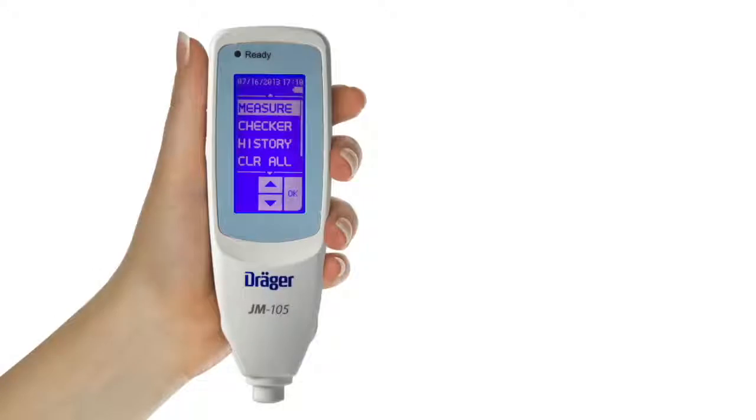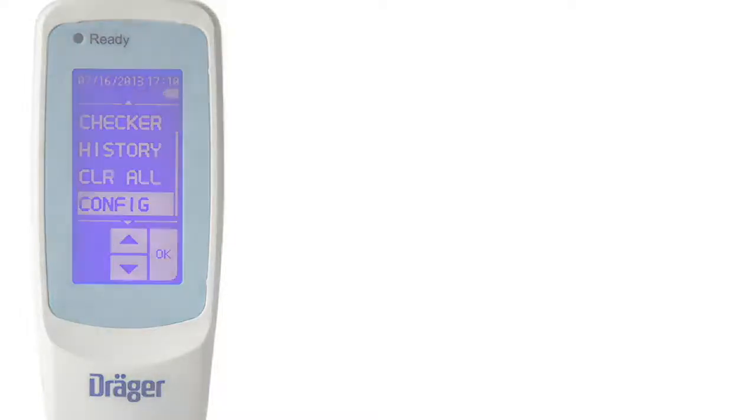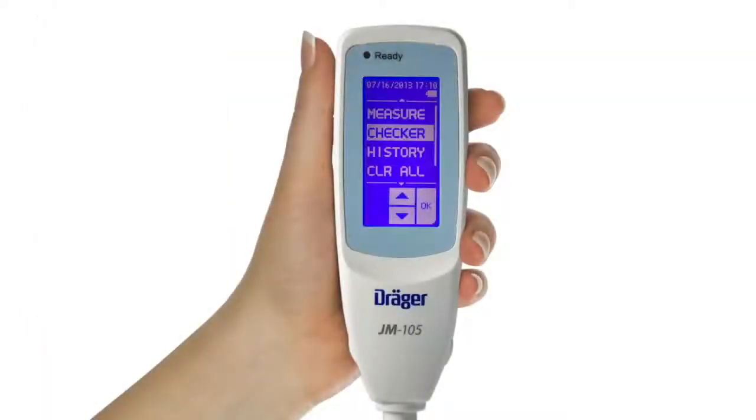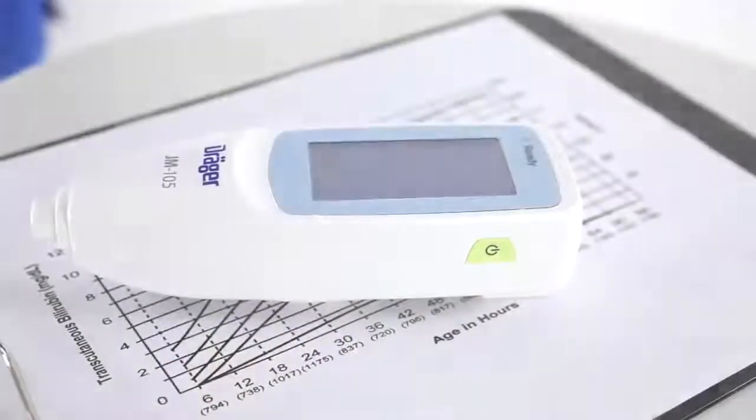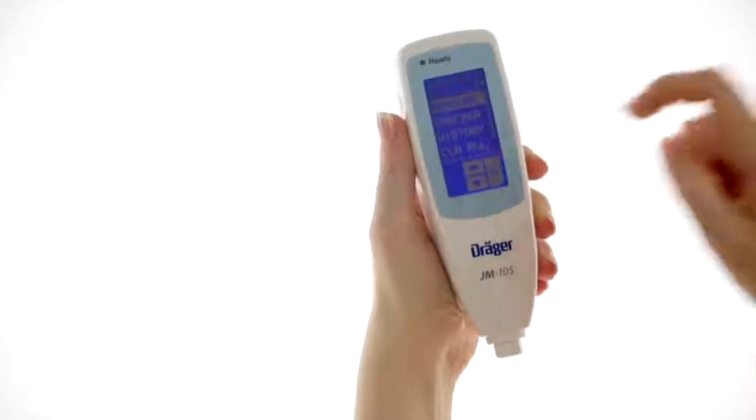There are 2 ways to select a menu item using the touch screen. The first is to highlight it by touching the menu item directly, and then touching it again to confirm your selection. On some screens you might have to scroll, using the up and down arrows to locate the menu item you want. Alternatively, you can use the arrow key to highlight the menu item and press the OK button to confirm your selection. If the touchscreen has not been used for 1 minute, the display will go blank. Simply touch the screen again and restore the screen.